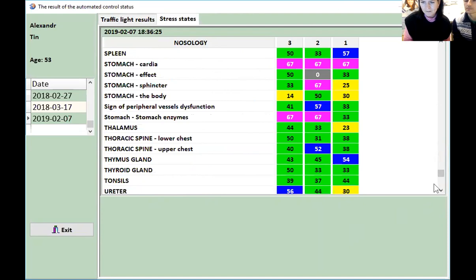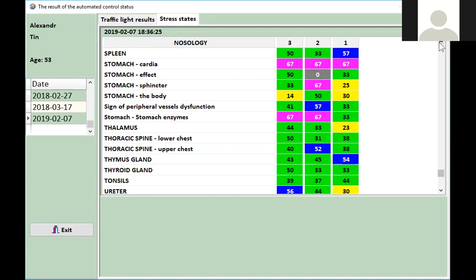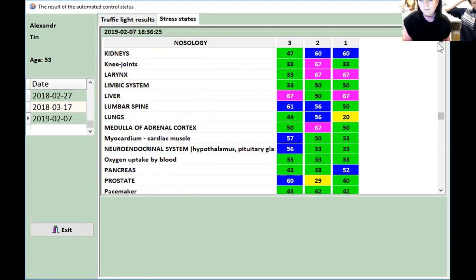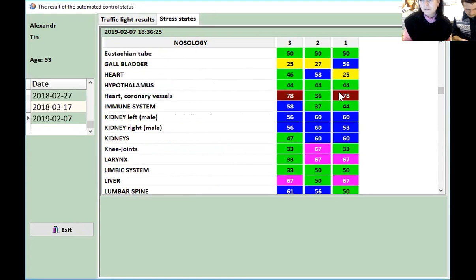So anytime there's overactivity up and down, that means that organ is stressed. It's not stable, so it's jumping. Also lungs, you see, like 20, 56, 44, not much, but still, you're searching for organs that are basically too obvious. You see gallbladder also, 56, 27. If you want to write down symptom treatments to the patient on the magnetic stripes, you can see his heart and vessels need to be treated a little more.